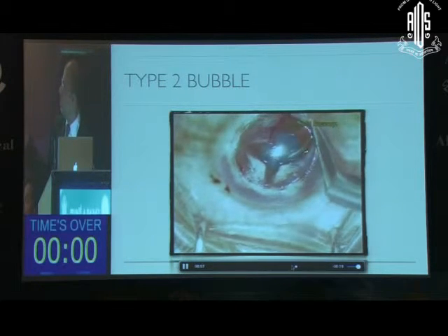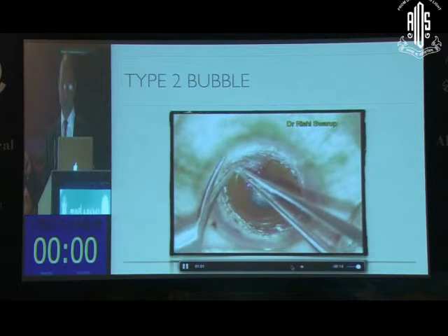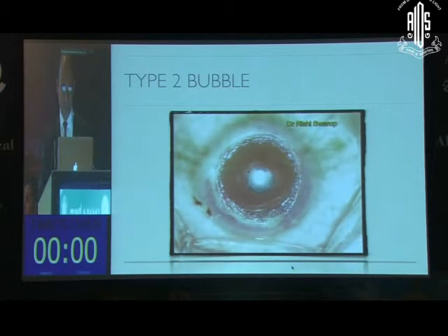This again is very delicate. It just ruptures on touch, unlike the Duas layer. So you have to be very, very gentle, and more often than not you can end up rupturing that layer.